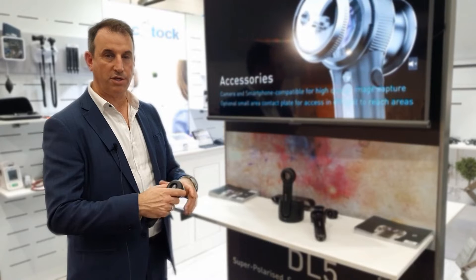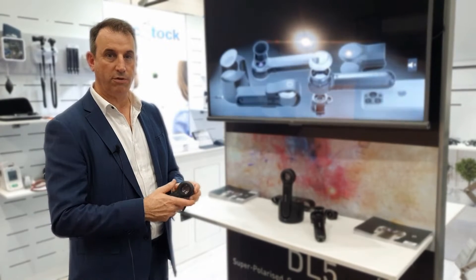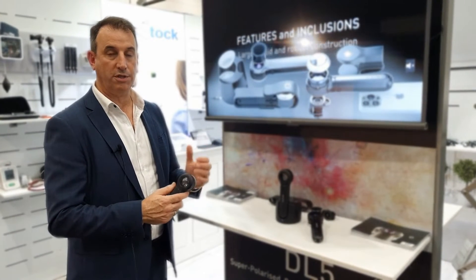The Dermlight Deal 5 has got a bigger field of view than any other Dermatoscope. It's got improved magnification and excellent clarity across the field. We've got a lot of additional features.